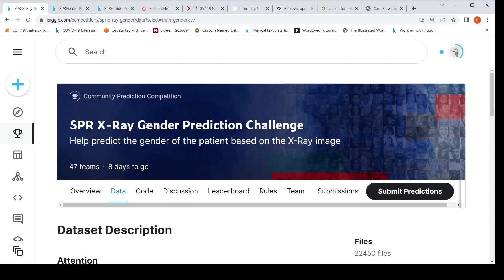The dataset here is from the SPR X-Ray Gender Prediction Challenge. This video will be organized in the following way: first I will explain about the data, then I will explain at a high level how the code is organized, and then we will deep dive into the code.